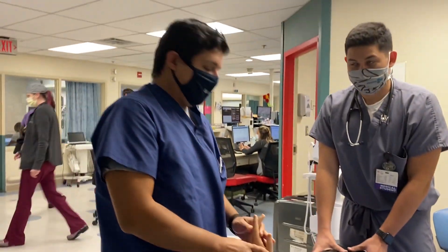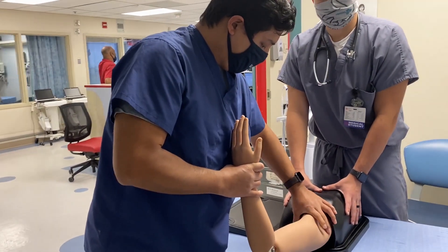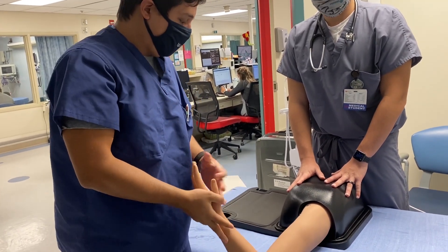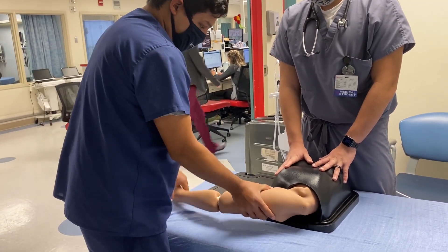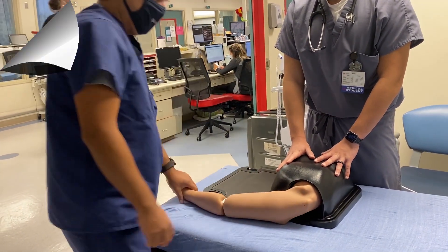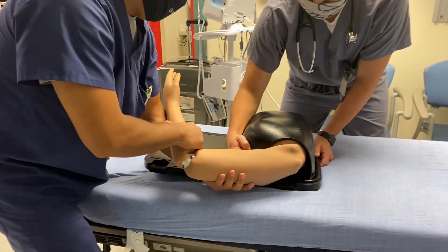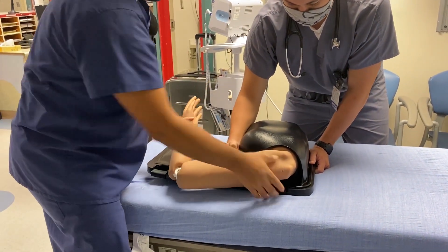Next, we'll do a posterior dislocation. With a posterior dislocation, the arm is going to be close to the body and a little adducted. You're going to pull traction on the arm and then reduce it. You need to put enough traction — adduct and it goes in. I was worried about breaking the model, but it's pretty tough.